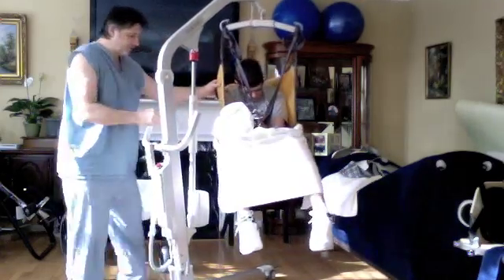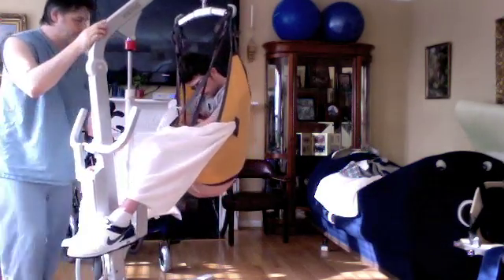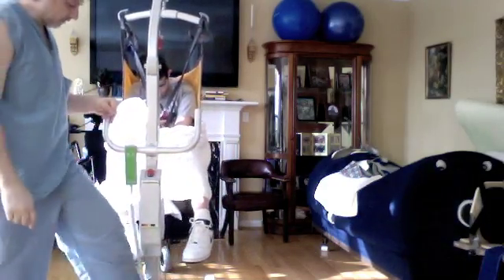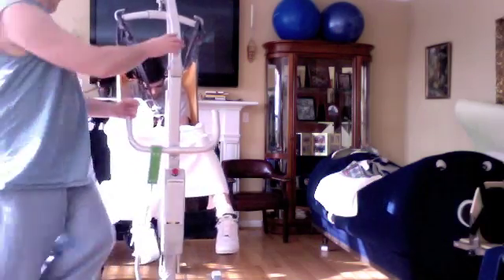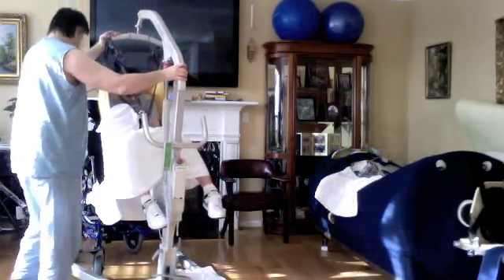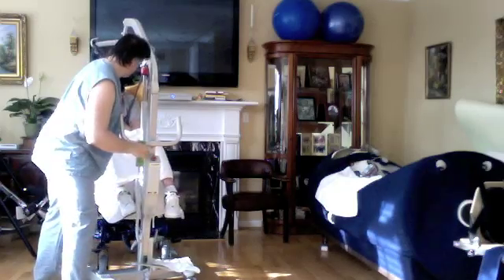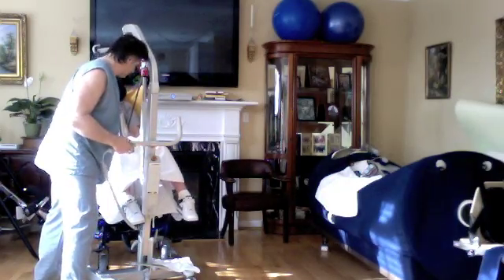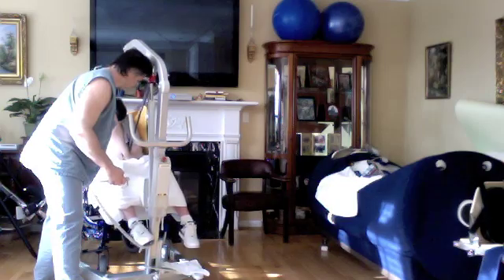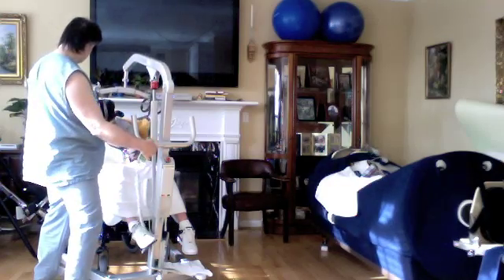So I keep his head in a tucked position, and the transfer is pretty simple. I get the legs in between the posts, turn them over. There's some legs down here at the bottom. I spread them out to get them around the chair. Let me see if I can do this without getting in the way. There he is. He's in the chair. I push him all the way back to get him well seated. Down he comes. See, he's still maintaining the head tuck.